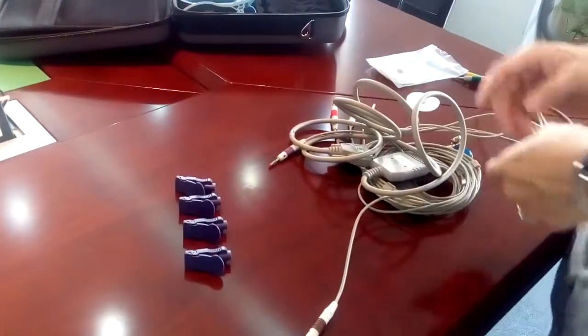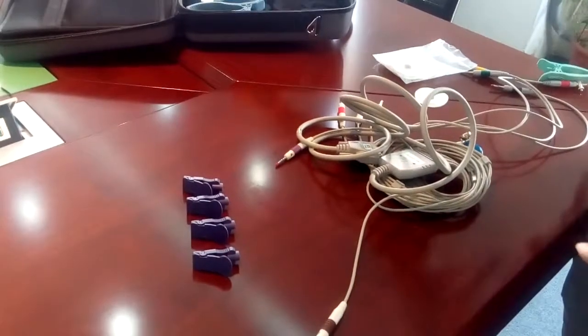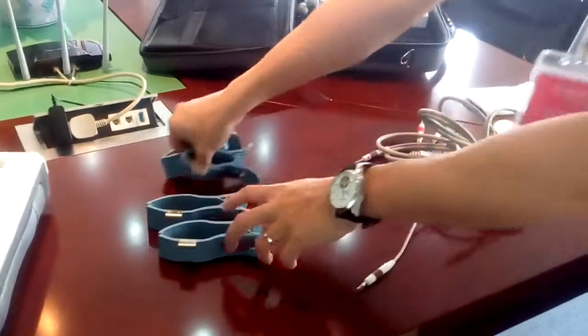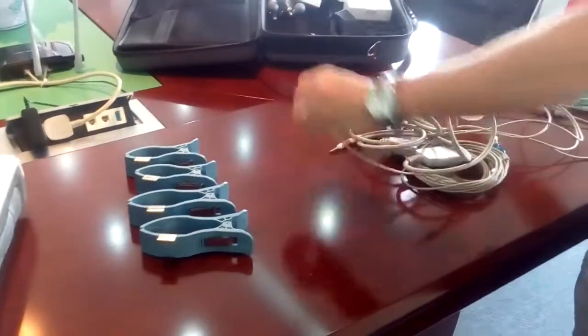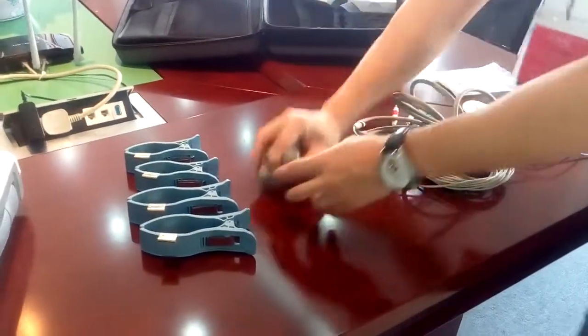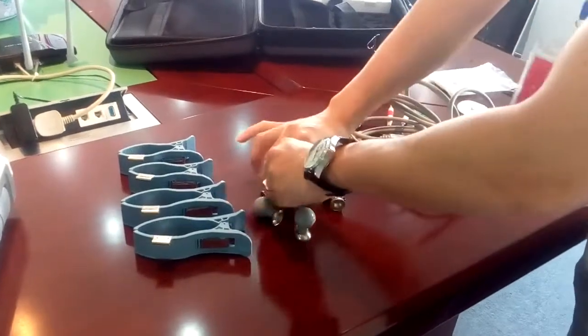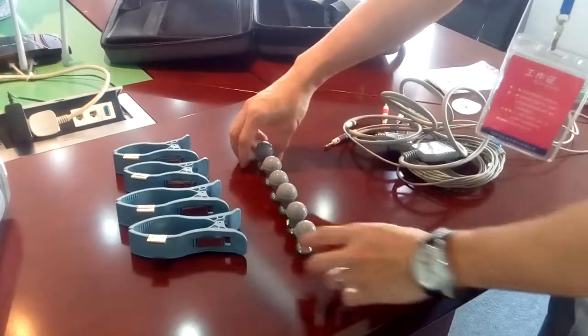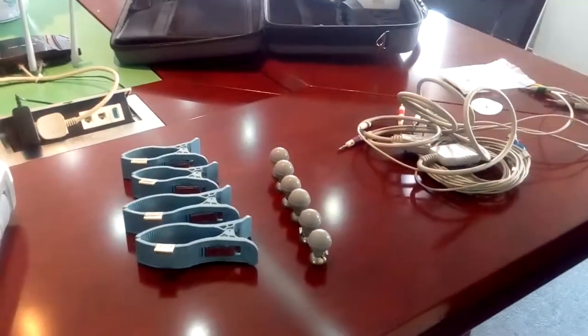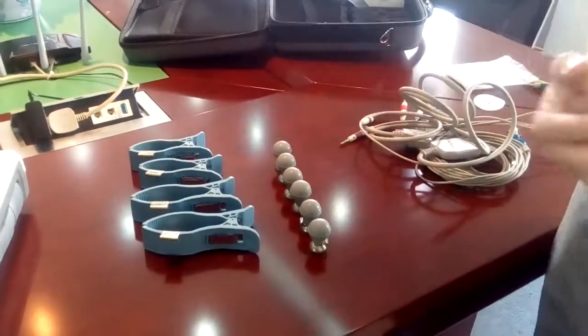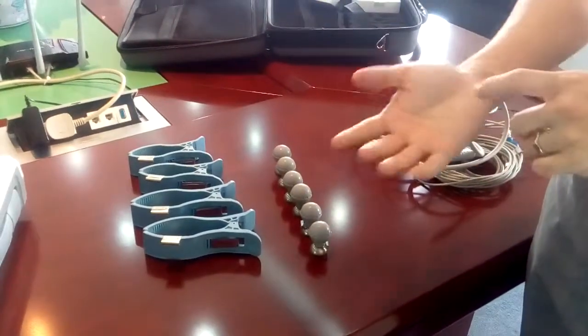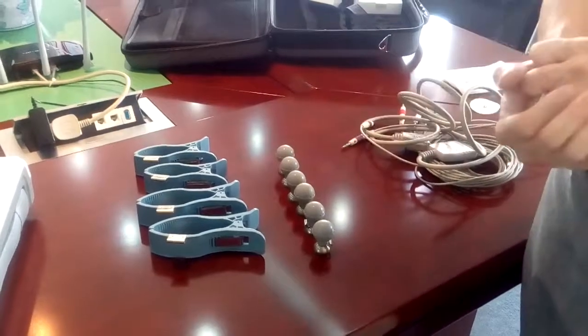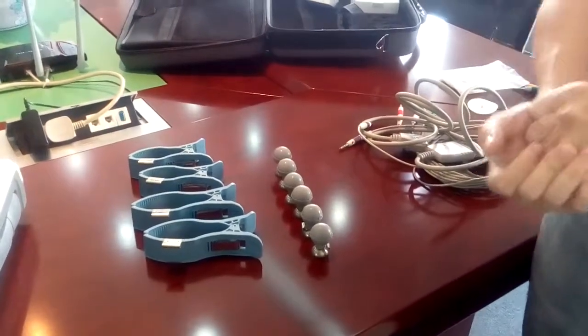However, when you purchase the ECG machine from CareWell, we only include the adult accessories: these four clamps and six adult suction electrodes. If you want to cover the three different patients—adult, neonates, and pediatrics—you have to buy different accessories from our company. Thank you very much.